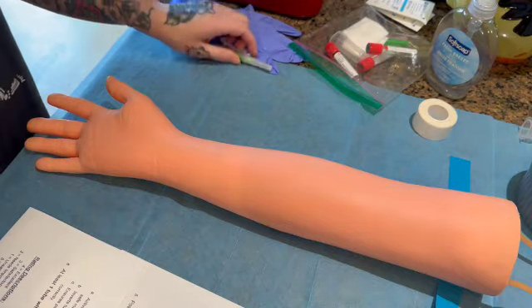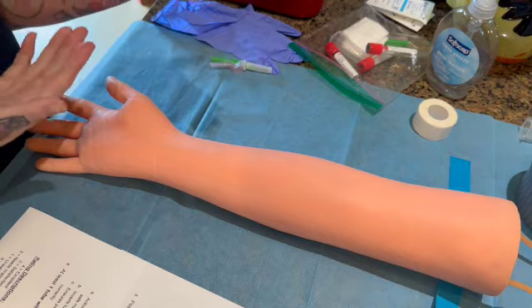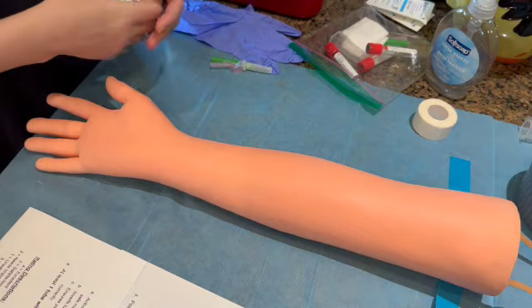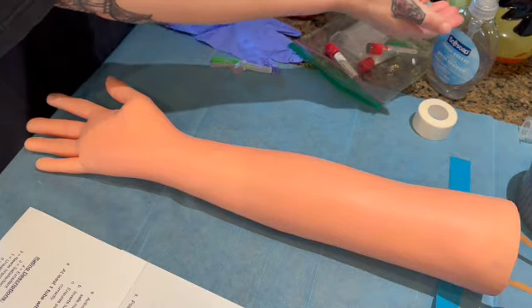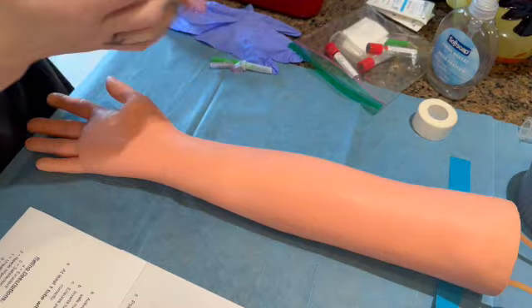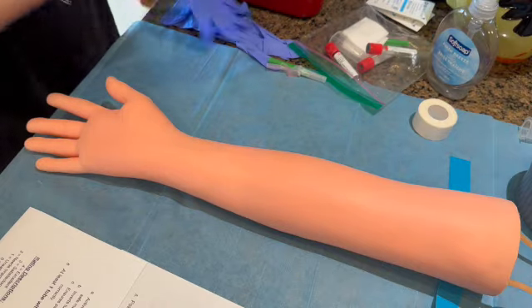I can't think of a date off the top of my head, but I'm going to confirm that that's the correct information that I have on my pretend requisition, and then I'm going to cleanse my hands and don my gloves. So we're going to pretend that that's also hand sanitizer because I don't have any. So we're sanitizing our hands, and then from here we're going to don our gloves.